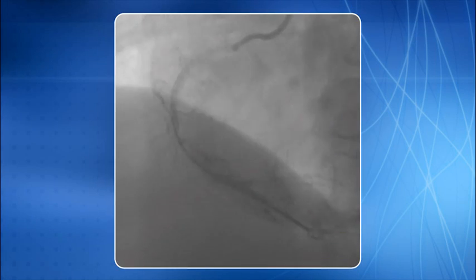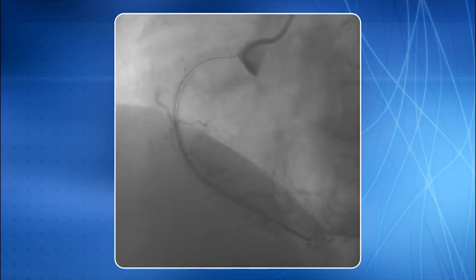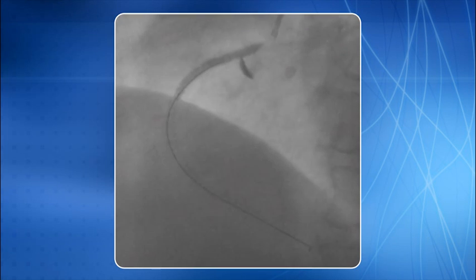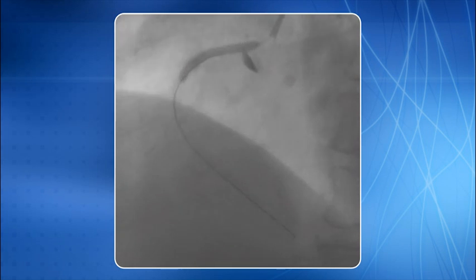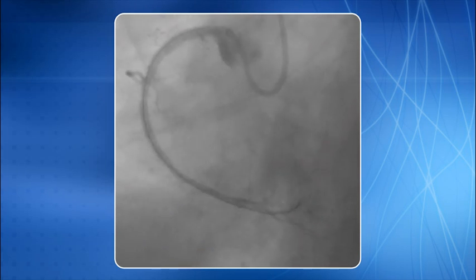Here is an example of RCA cannulation using an AL 1 guide catheter. Note that the tip of the guide catheter is not coaxial to the RCA ostium. Non-coaxiality is better revealed in this angiogram. This led to aorto-ostial dissection, requiring deployment of multiple stents including covering the ostium of RCA to seal the entry of dissection. We strongly recommend against the use of the AL guide catheter unless you are an experienced operator, as it is a more complication-prone catheter.